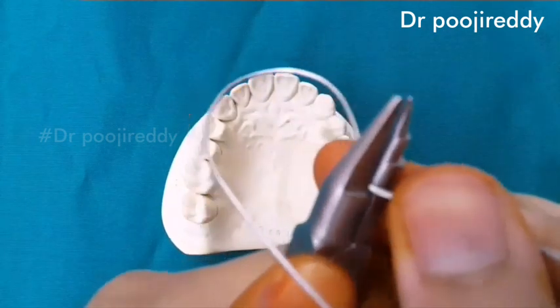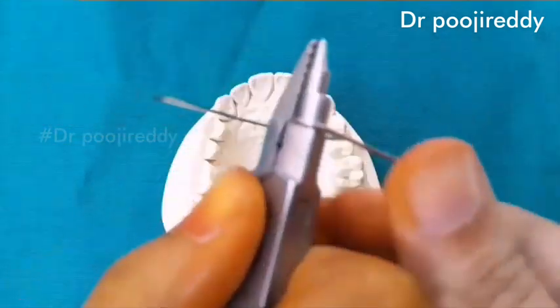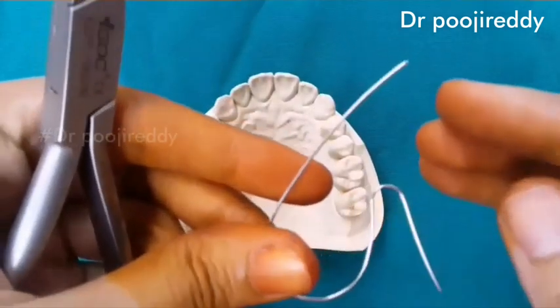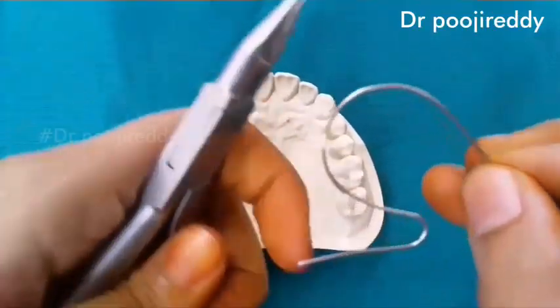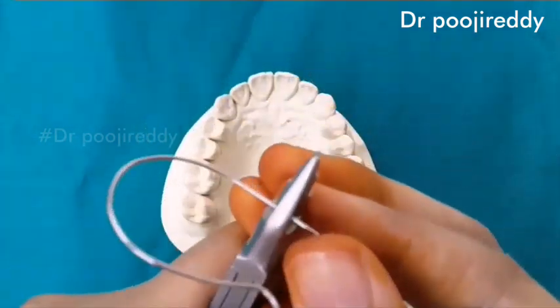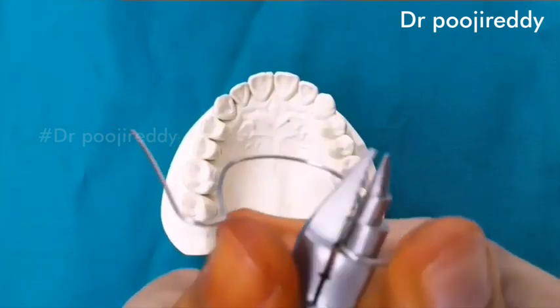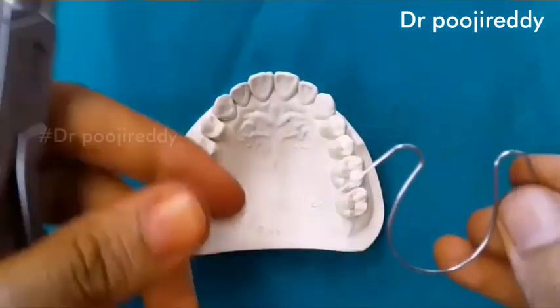Bend the orthodontic wire around the round part of the universal plier. So we have made the first arm of the coffin spring — the right arm — and then followed by the left side.